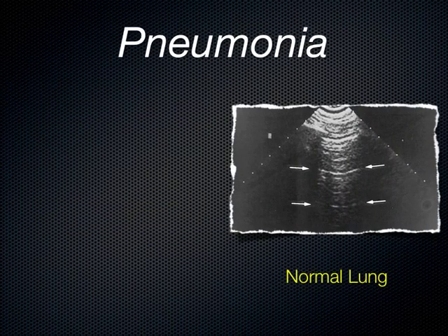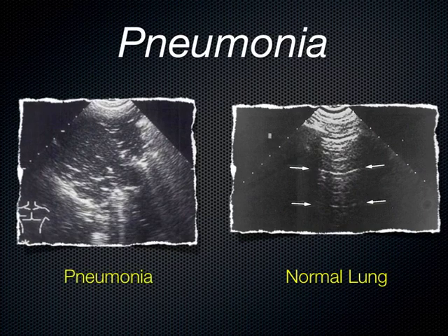So if you go in all 8 quadrants, basically, 4 on both sides, you might be able to even say this is a right upper lobe infiltrate and compare that with your chest x-ray, because not everybody has full pneumonia on both sides, and it's a good thing. You might have one lobe affected on either side, and you can start to hone your skills by trying to find it and then comparing it to the chest x-ray.